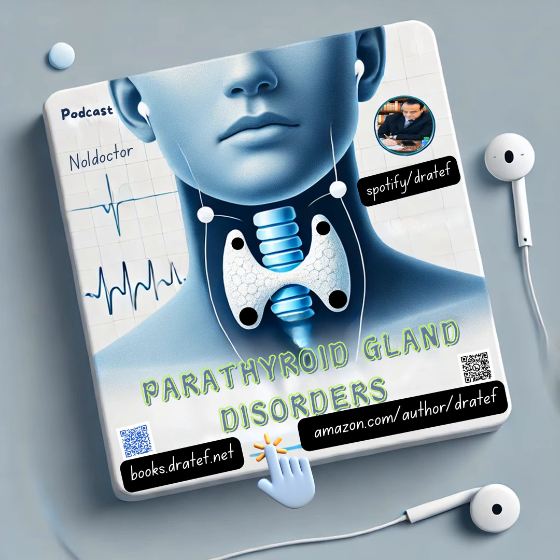It's all about analyzing the trend then, watching those PTH levels plummet after the gland is out. Kind of dramatic. It is. It's like watching a stock ticker. Except instead of tracking market fluctuations, you're monitoring the body's response to surgery in real time. And for the patient, knowing that the surgeon has this immediate feedback can be incredibly reassuring. Oh, for sure. That makes a ton of sense. Takes away some of the uncertainty of surgery. Okay, so that's the 50% drop protocol. What about the other one?